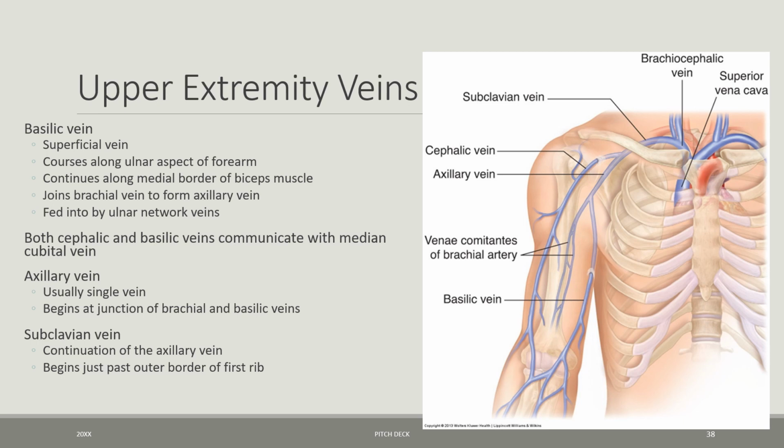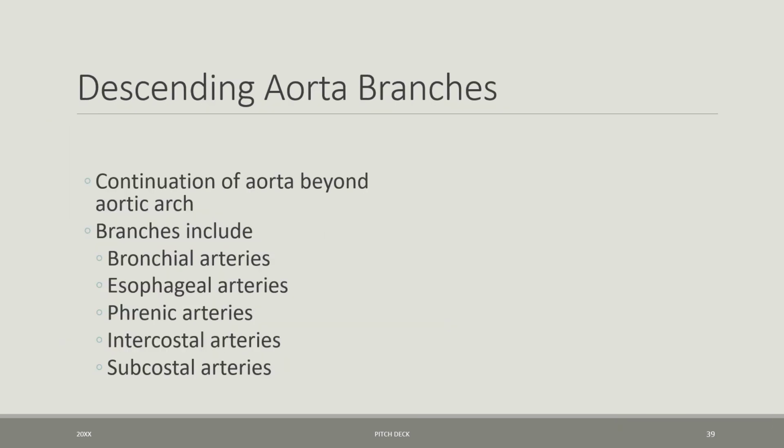All right. So that brings us back out of the arm. One of the things I find that's really useful when you're studying your vessels anywhere, but especially in the arm or the legs, is really to do some flow charting.